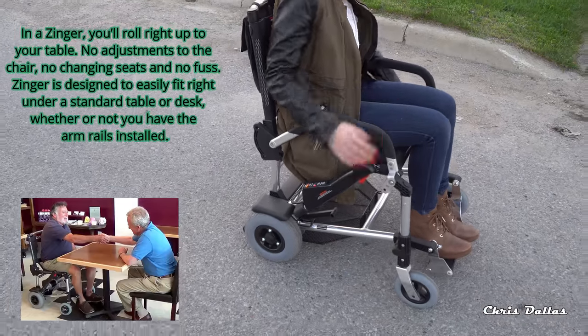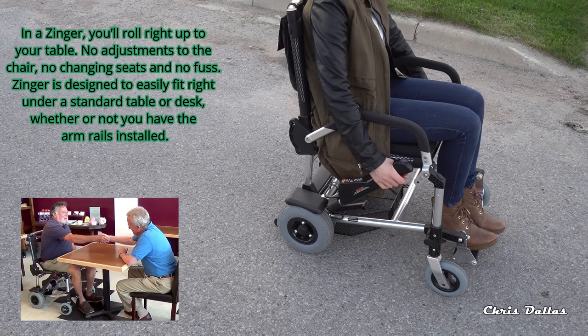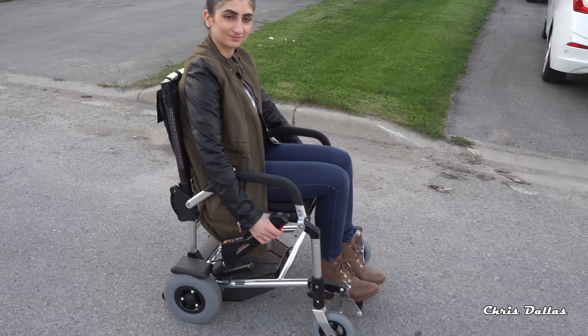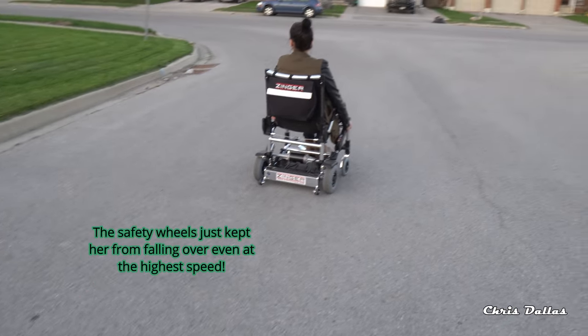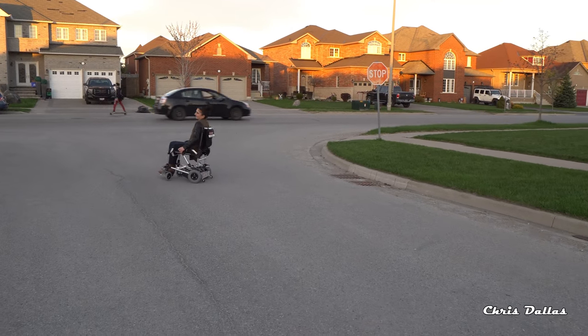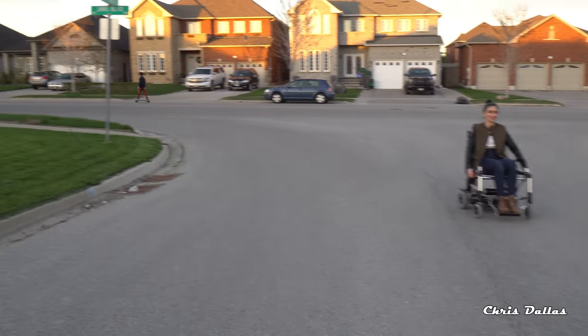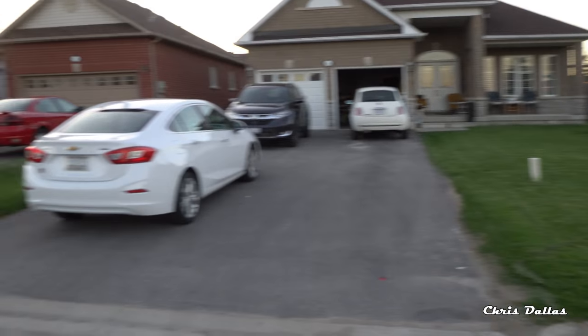Let's see how fast the third speed goes. For somebody who wants to use it outside outdoors, you can actually go on grass. It's got the safety wheels in the back, so when you do pull a wheelie like she just did — oh, there's a guy on an electric skateboard — she's flying by!